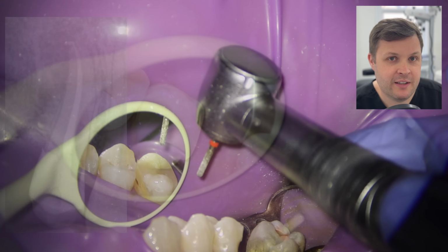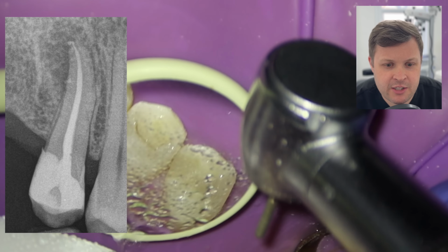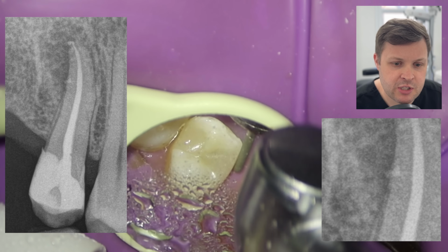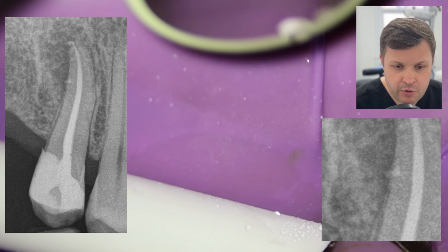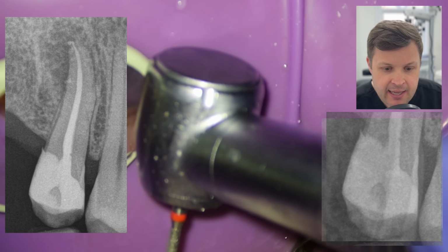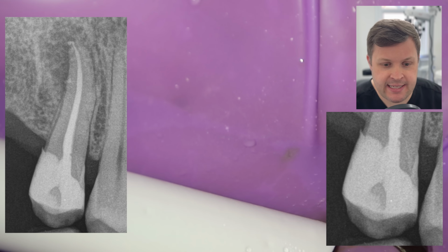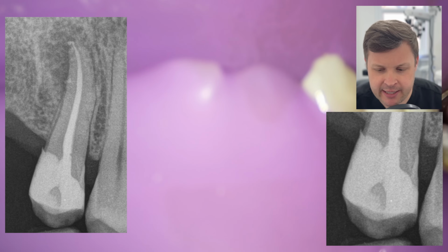And we look at the post-op radiograph. We've got a nice little sealer puff at the end. I don't like to have a sealer puff, but this is a nice sealer puff. We've got a little bit of a lateral sealer puff as well, and I suppose you could see on this x-ray that the apical inflammation moves quite far up the tooth, and it's a bit of a lateral one as well. You can see a little bit of sealer there, and also the dentin bridge, and you can see that the SDR has flowed nicely into the whole coronal aspect of this tooth, and overall a really nice result.